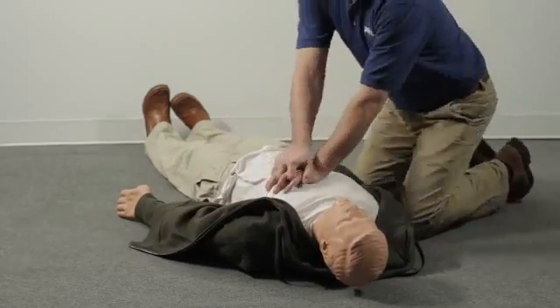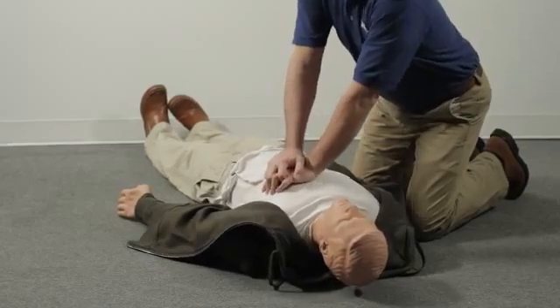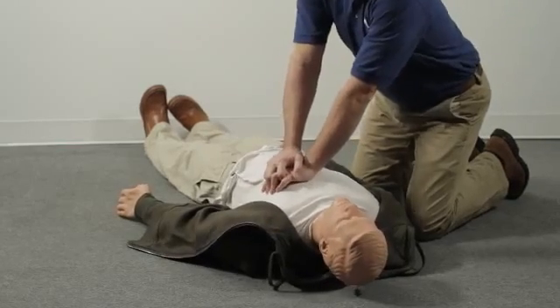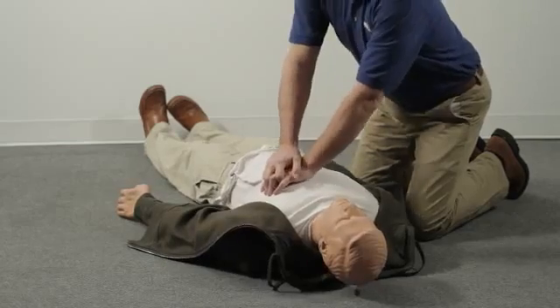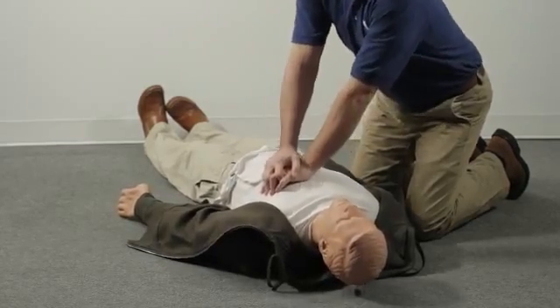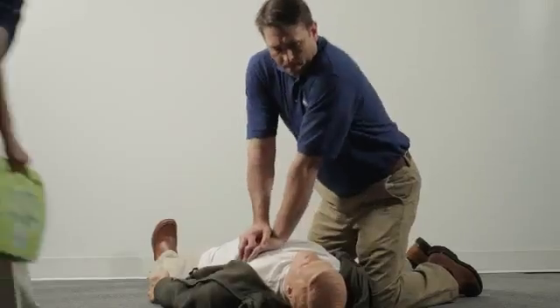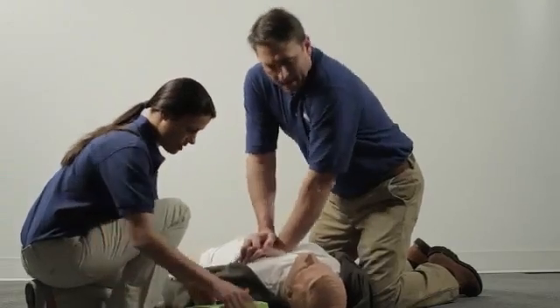If the person is unresponsive and not breathing normally, expose the chest. Place your hands between the nipples in the middle of the chest. Begin chest compressions. Continue compressions and rescue breathing until the AED arrives. When it does, make sure the person isn't touching water or metal. Place the AED Plus by the person's shoulder and turn it on.